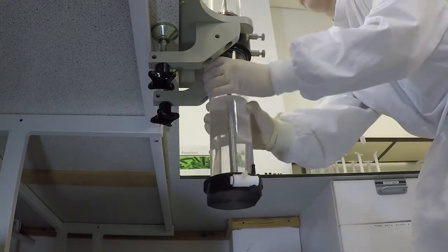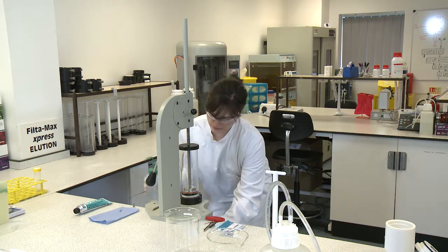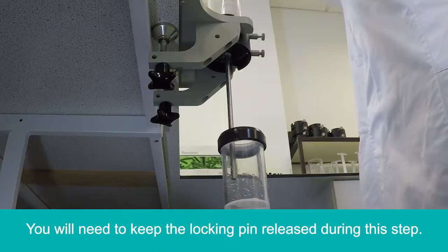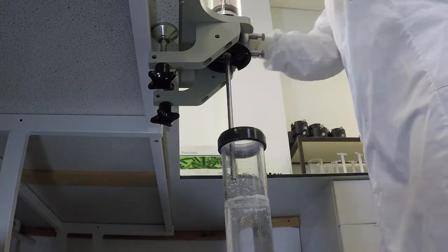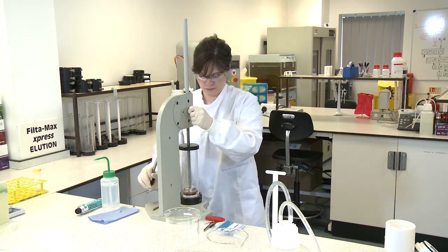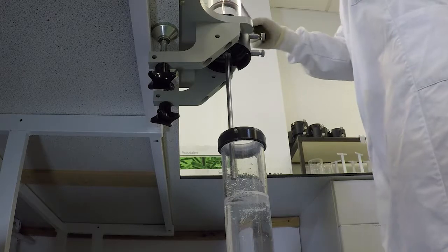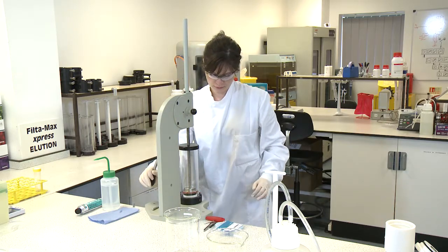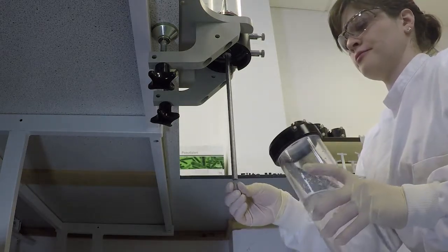Detach the assembled concentrator tube and hold it directly below the steel tube. Rinse the outside of the steel tube with PBST. Expel the remaining liquid from the elution tube by compressing the foam five times. Once complete, push the plunger handle back to lock into place and insert a rubber stopper in the end of the steel tube to prevent any loss of sample.